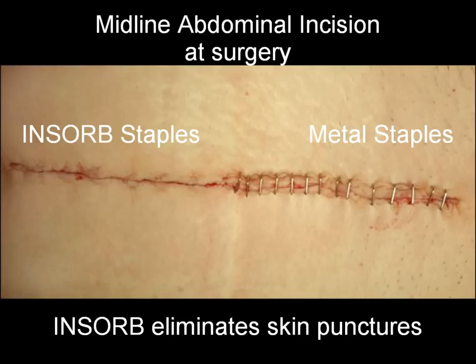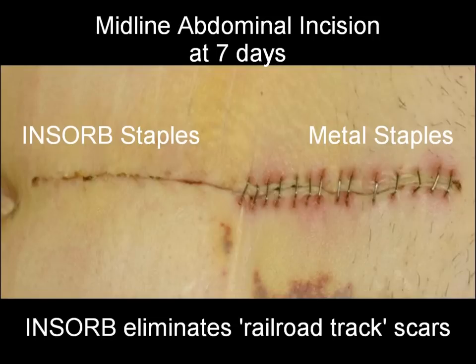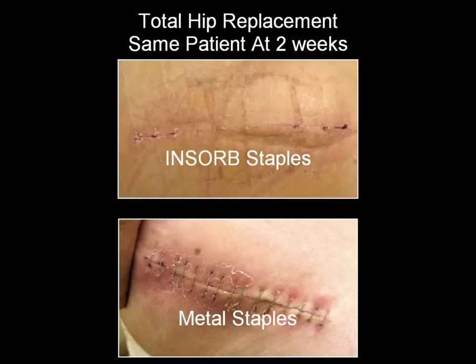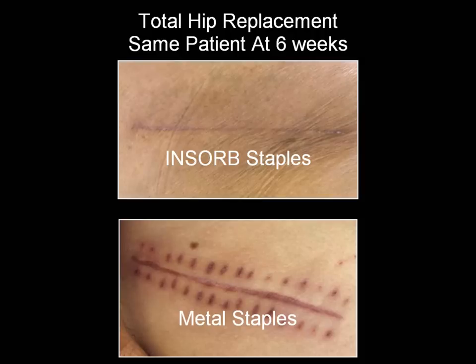The InSorb stapler eliminates the external skin punctures created by metal skin staples, which can result in railroad track scars. And the InSorb stapler eliminates the anxiety, cost, inconvenience, and pain associated with metal skin staple removal. Clinical experience has shown that patients overwhelmingly prefer absorbable skin staples to metal skin staples.